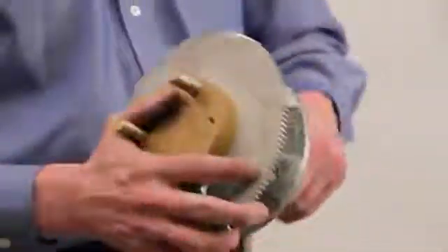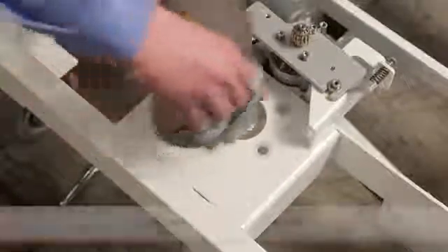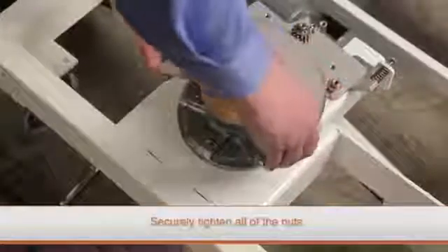To replace the hub assembly, align the studs with the holes in the frame. Insert the hub assembly and install and securely tighten all of the nuts.